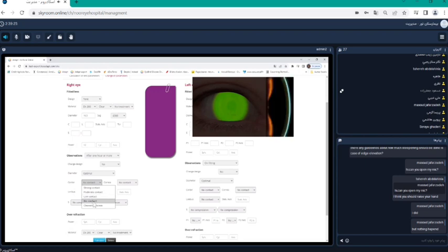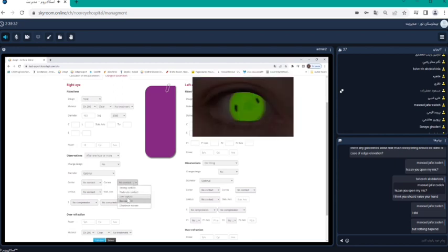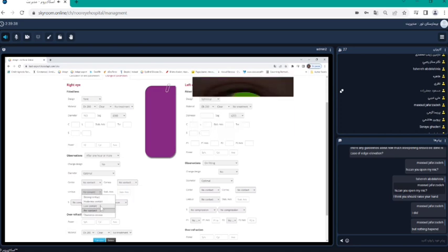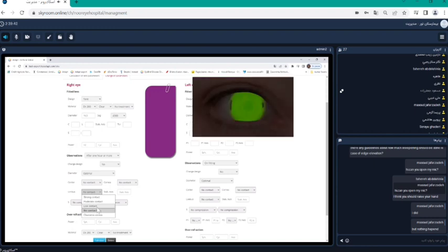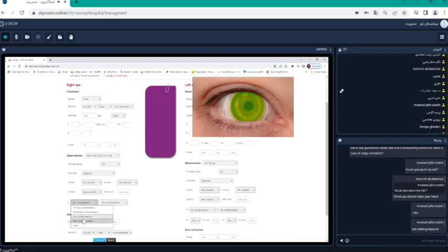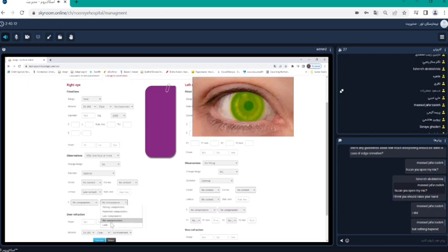Well, in the picture, we had no contact at the center. At the cornea, you have low contact, moderate contact, strong contact. Well, we had no contact. At the limbus, it was the reverse. We had a low contact, not moderate, not strong. So I say low contact. This is what I can see. Then on the sclera, you have no compression, low compression, moderate compression, or strong compression. Well, we had no compression. And you can do that at the flattest meridian and the steepest meridian at the same time.